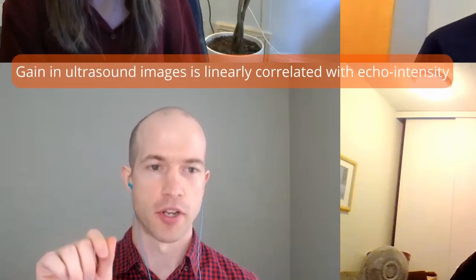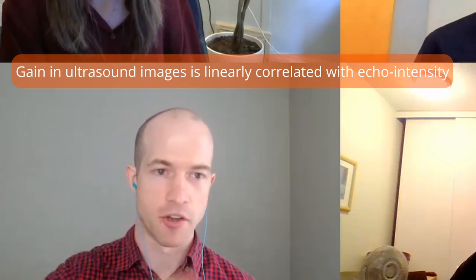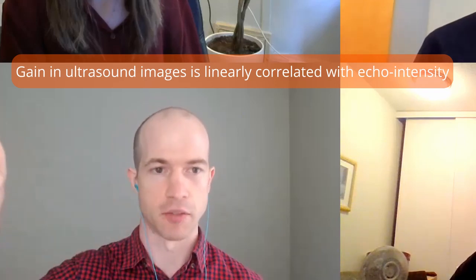Yeah, I don't have any data and I can't point to any data to demonstrate that, but I think it does have those advantages. The few things I can mention that have been done: we know one of the differences between different ultrasound units is the gain setting, like how bright that image is. If you were to increase the gain and look at the same muscle, you'll see basically a linear correlation with echo intensity.